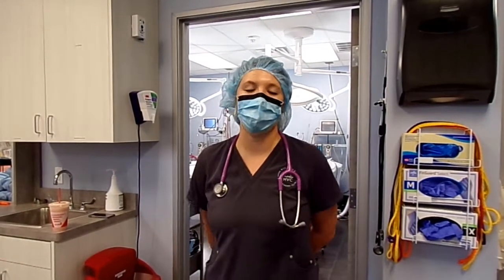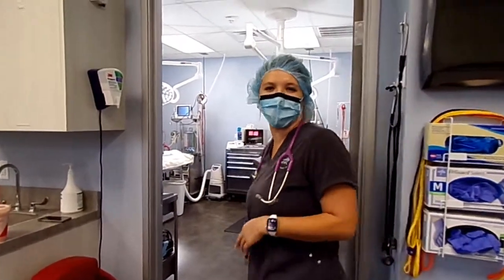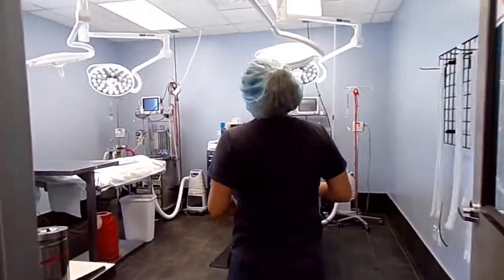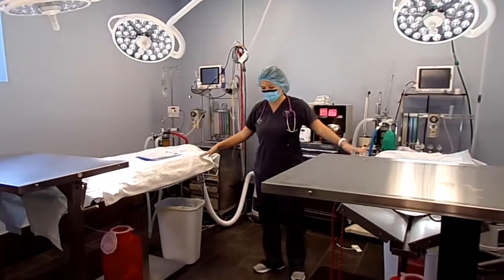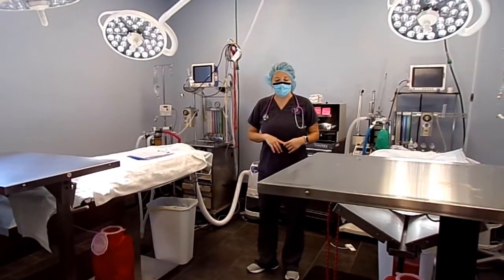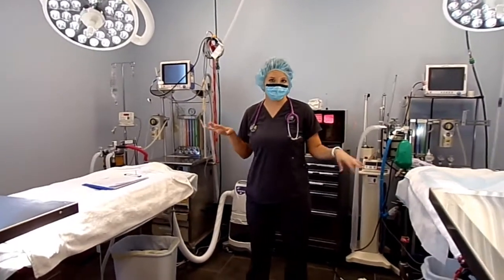We are in our OR right now in our little surgical unit. I want to bring you into the OR and talk about some of the equipment. In our OR we have two surgical tables so we can pump out lots of surgeries at the same time — two doctors and nurses working on two separate patients.